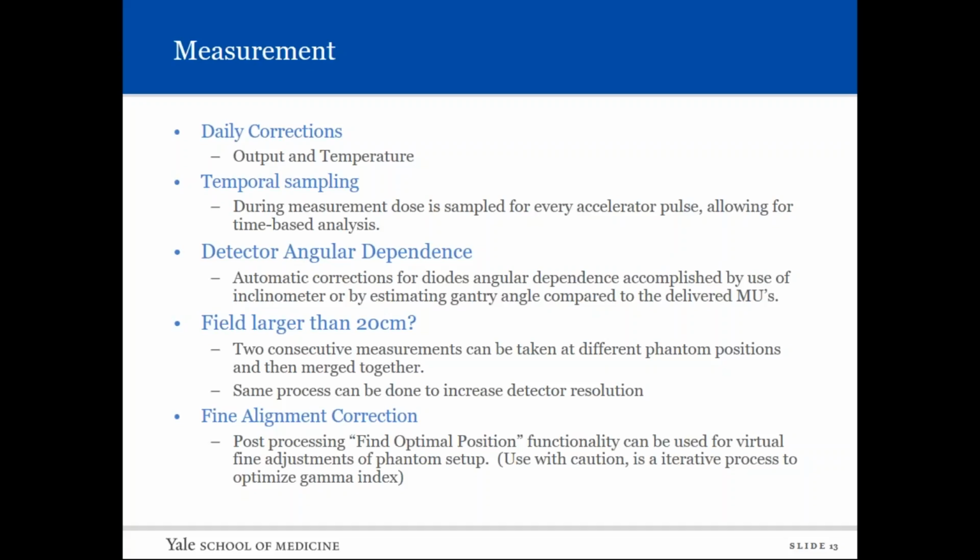Like I said earlier too, the pressure or temperature sensitivity is about 0.4 per degree, so you really should measure the temperature every day in your room. I've seen a lot of clinics just plug in a generic room temperature, 22 degrees or something, and they're always curious why their measurements are off by 4 or 5% or something, and this actually does explain it.